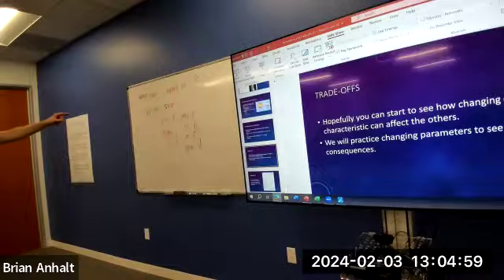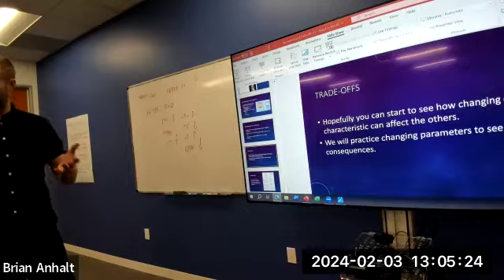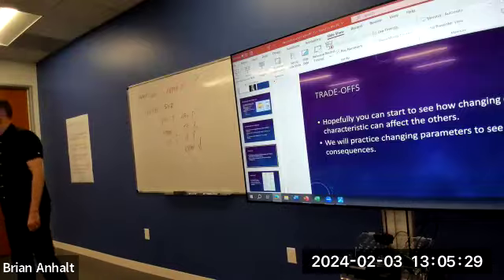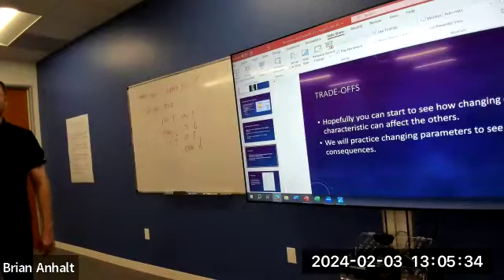I can halve my phase matrices, but then what? What's the problem with doing that? I could lower my NEX, I could halve my phase matrix, what happens? My SNR is now crappy and my resolution's crappy. Did I do the patient an injustice? Maybe, right? The radiologist is going to tell you that. You want to make sure that the radiologist can still read it, you're still providing patient care, but that you got the job done in a good amount of time. What else?